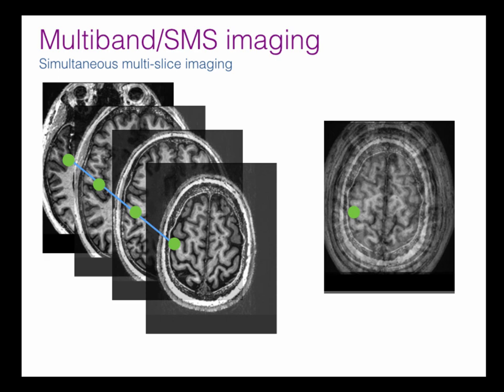Okay, and so what we end up with is these 4 excited slices, and then we have a corresponding point in the image. Now we're only doing our imaging in X and Y, so if you imagine the through-plane direction is Z, then when we do our imaging, we're only discriminating according to the X and Y position, and we end up with a superposition of all the slices, which looks like a kind of mess, right? Because it's all just piled on top of each other. Okay.